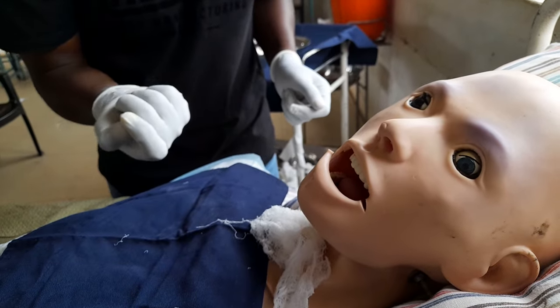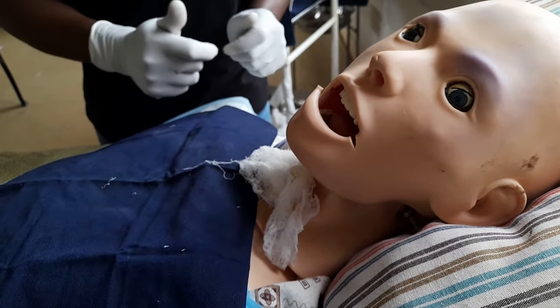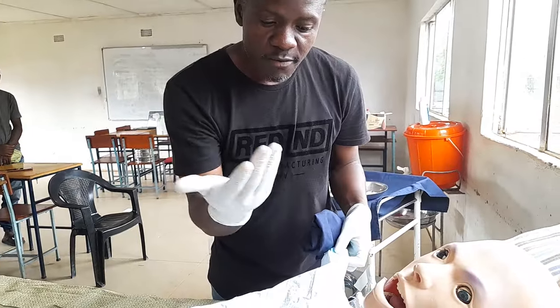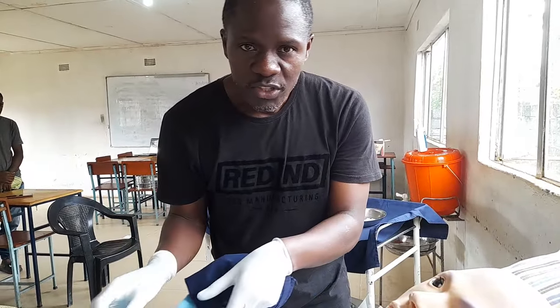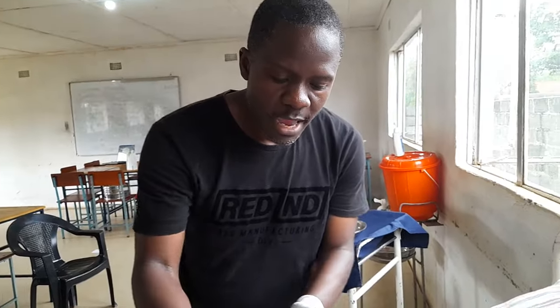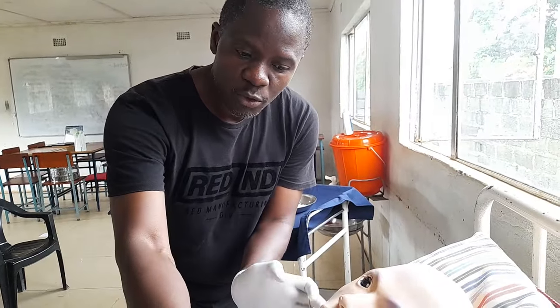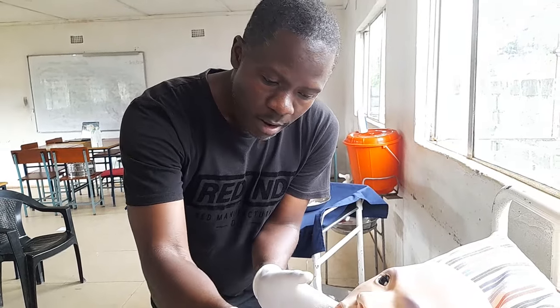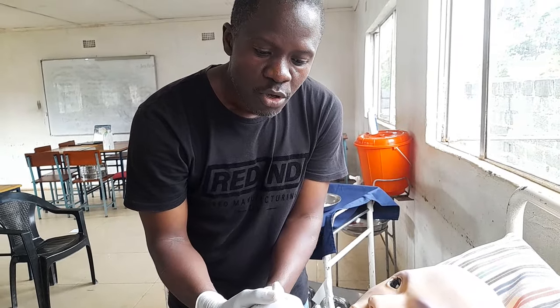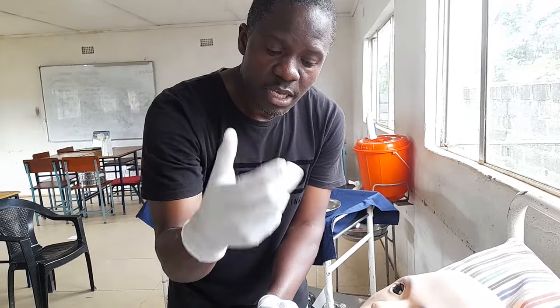If you have industrially made filters, you can place one over the tube opening to filter the air the patient breathes so they do not breathe dry air. Thank the patient: 'Thank you very much for allowing me to do the procedure. If you feel any discomfort, please call on me. If your neck feels like it is bulging — what we call subcutaneous emphysema, meaning air is seeping under the skin — or if you are failing to breathe, press the call button immediately.' In ICU there are call buttons for patients to press when they cannot breathe properly or when there is excessive mucus production.